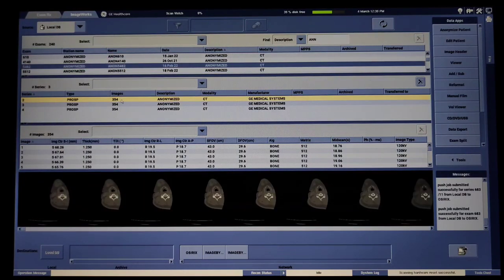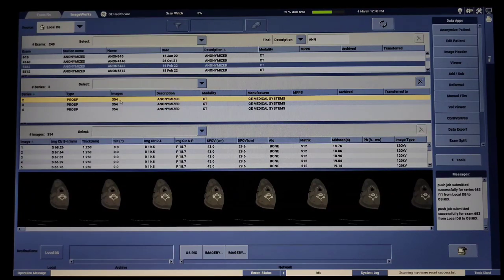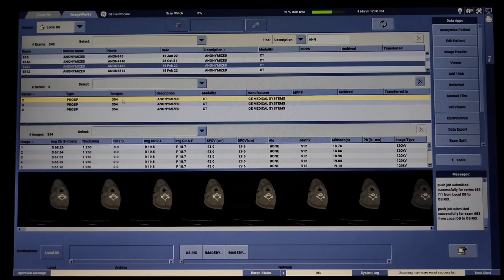First we have to select bone window. Because if someone has a CT scan on a shoulder, it will be a trauma case or an RTA case. So we have to scan the shoulder to see fractures. If the patient has only pain, dislocation, or muscular pain, then the doctor tells the patient to go for MRI. CT scans are used only if a fracture is suspected, so we use the bone window.